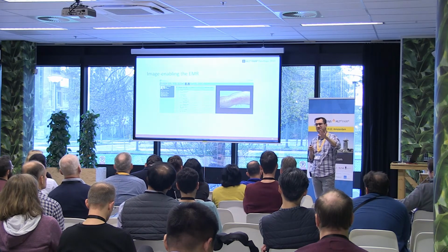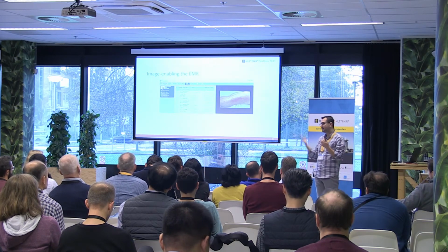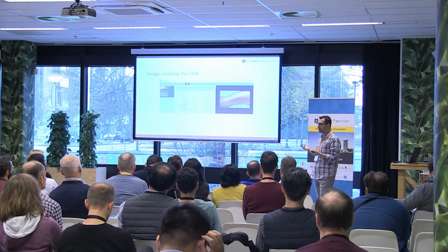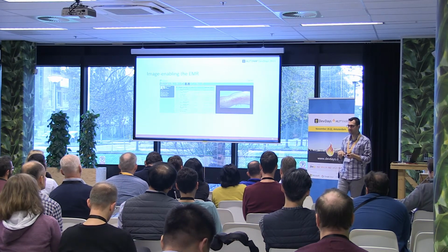There's a lot more to these images than what people realize. A lot more. For starters, if you compare these images to an image you take with your phone, image you take with your phone is 8 bits. Those images that are captured by these machines usually are 12, sometimes 16 bits.